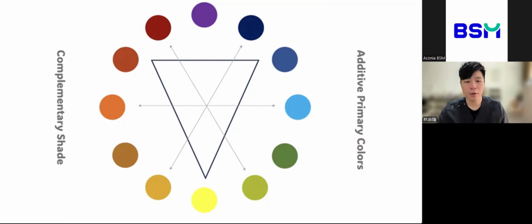For example, some zirconia brands after sintering will look more yellow. If at the same time you also need to lower the value, we can apply a thin blue stain on the surface to neutralize the yellow. And this concept is the complementary color concept, okay?